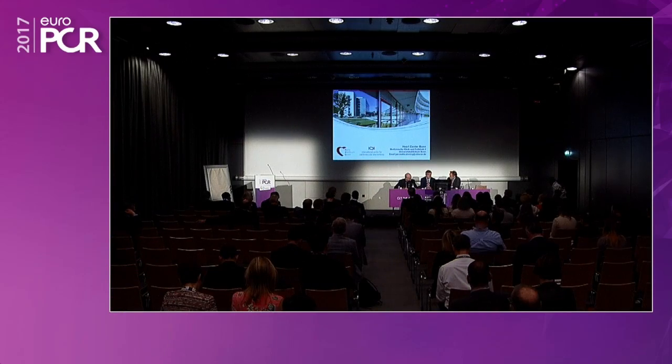That's a true point. I believe bicuspid valves, of course, are more frequent in younger patients. And one other feature of the LOTUS, the full repositionability, is probably a very important point if you go to younger patients with a specifically difficult anatomy, which could be a bicuspid or heavy calcifications, because you can just take it completely off if you're not happy with the outcome. Therefore, I think that's a good feature. But I think we all agree that LOTUS is doing very well in bicuspid valve.